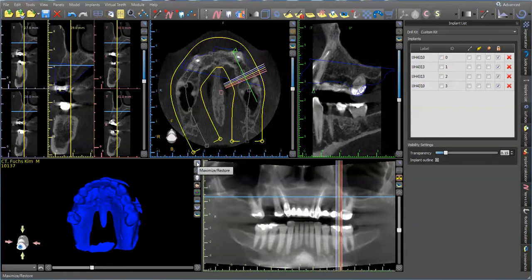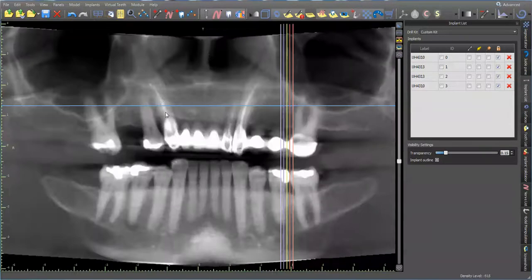This next patient was referred to us for a failing bridge from 6 to 11. I'm sorry, 6 to 10, and then 11's failing. That's tied into number 14. We discussed several different treatment options. This tooth is actually pretty good. All this has to go. This tooth's great, so is this molar.